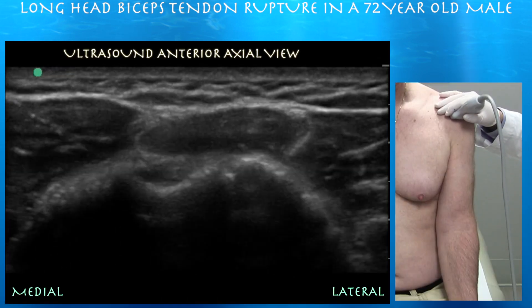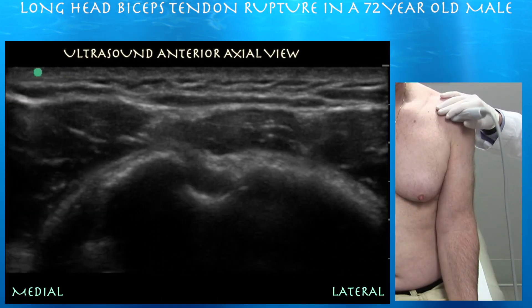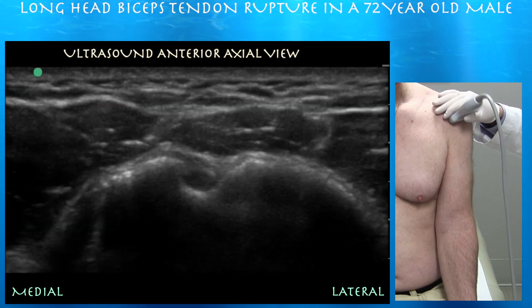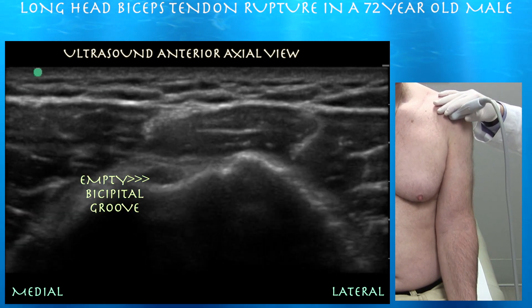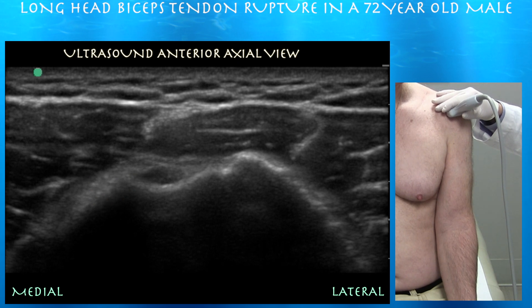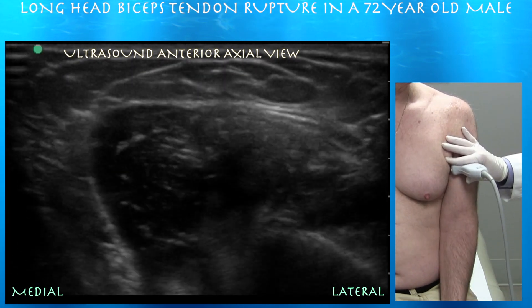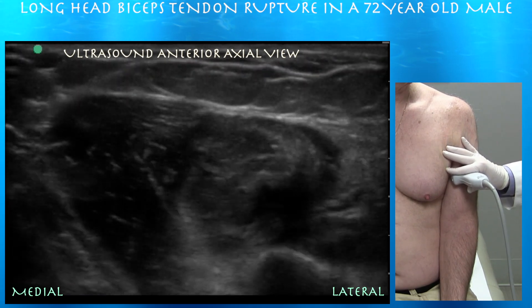Here's our first clip. You can see that groove but we just don't see tendon — it's just an empty space. You can kind of see the sleeve, the coracohumeral ligament on top, and just the biceps muscle coming into play.